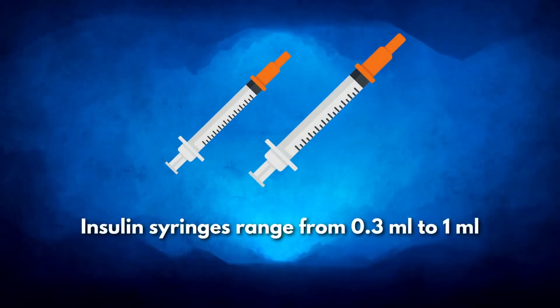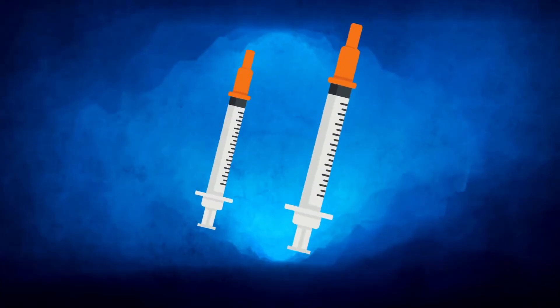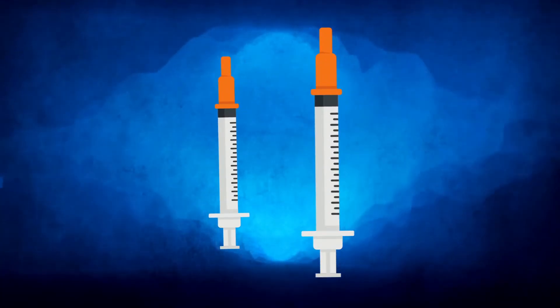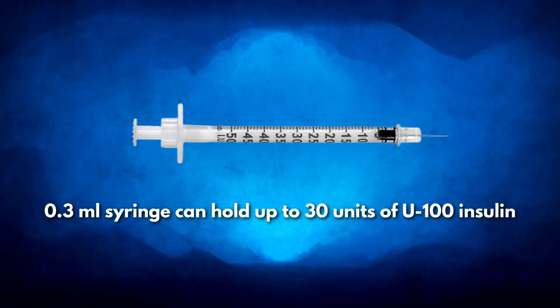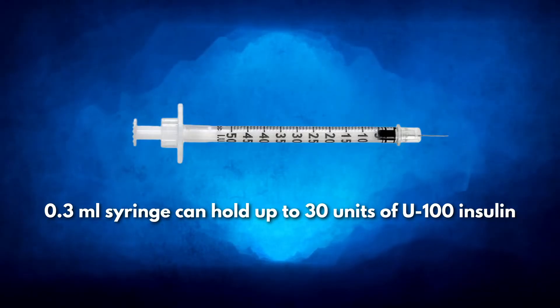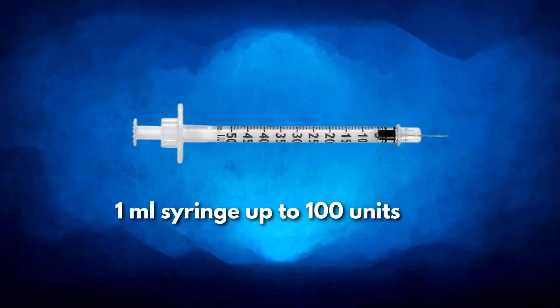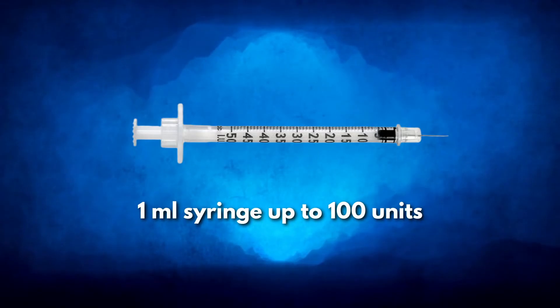Insulin syringes range from 0.3 milliliters to 1 milliliter, each holding a corresponding amount of insulin. For instance, a 0.3 milliliter syringe can hold up to 30 units of U100 insulin, a 0.5 milliliter syringe up to 50 units, and a 1 milliliter syringe up to 100 units.